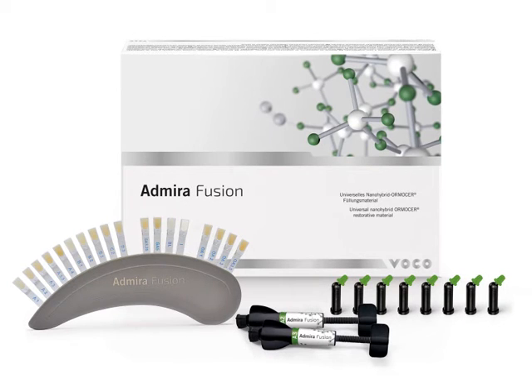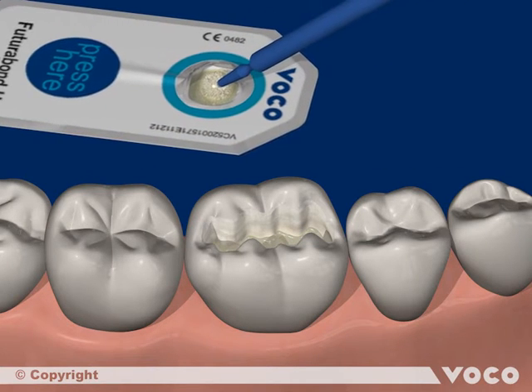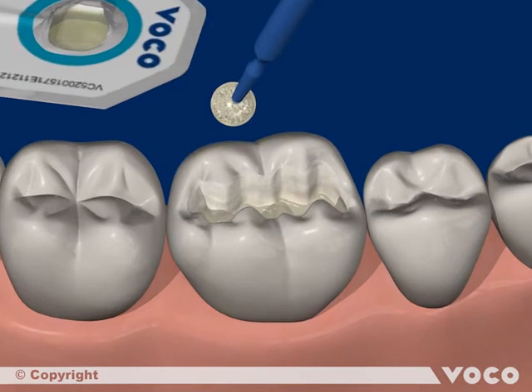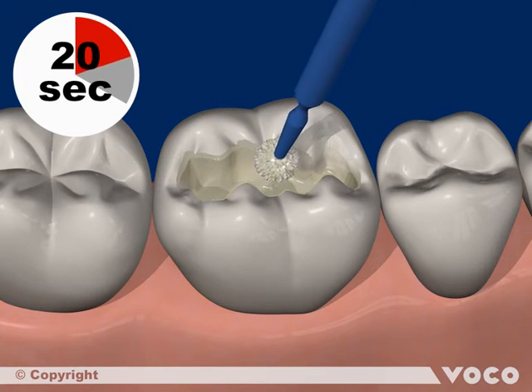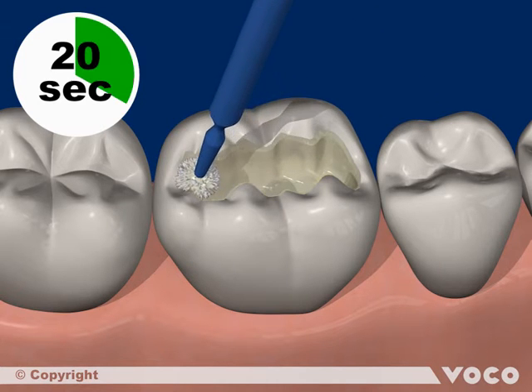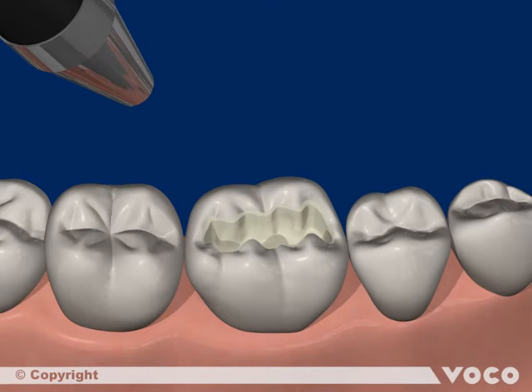In the following we will show filling a class 1 cavity with Admira Fusion. Cavity preparation, cleaning and drying are followed by the application of the adhesive, here Futurobond U, which is used in self-etch mode. After activating and opening of the single dose blister, the adhesive is applied homogenously to all cavity surfaces and rubbed in for 20 seconds. The adhesive layer is then dried off with dry, oil-free air for at least 5 seconds.